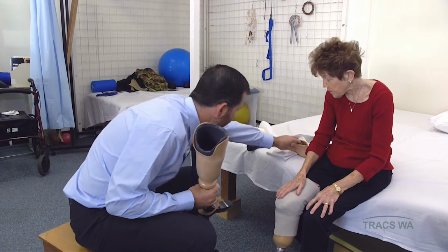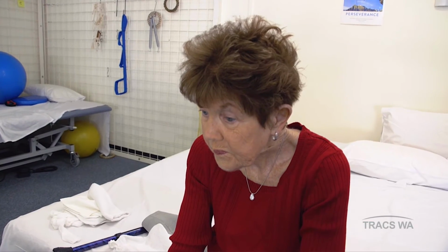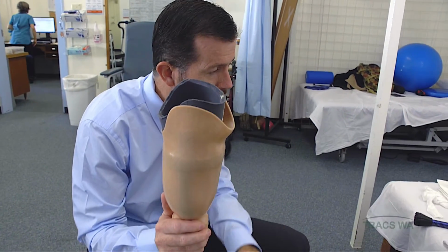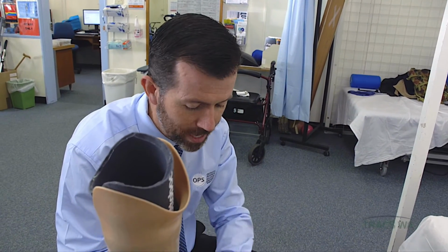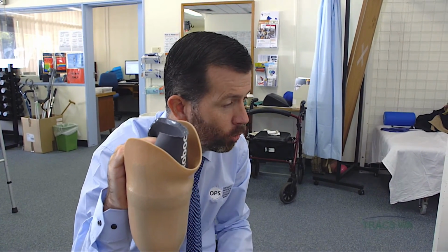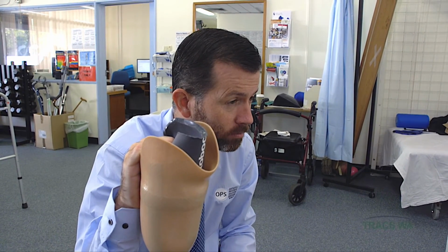So the other part of this prosthesis, as I explained to you, is the cosmetic finishing. We get some funding to improve the appearance of the prosthesis. What we do is fill the area between the foot and the socket with foam, and we shape that to match your other leg. And then there's a couple of different types of coverings. There can be silicone and rubberized coverings that begin to make this look a little bit more like a leg, so that you could wear a skirt and have the prosthesis appear a little bit more like a leg.